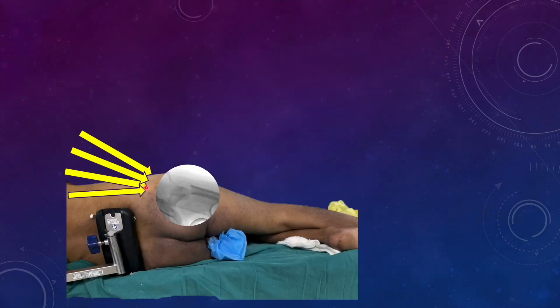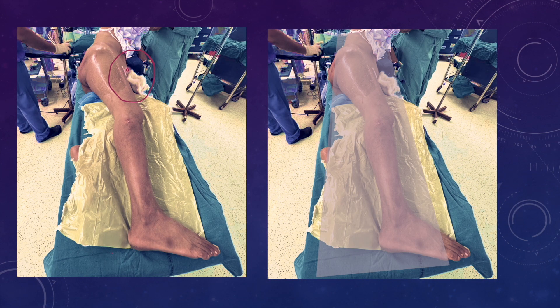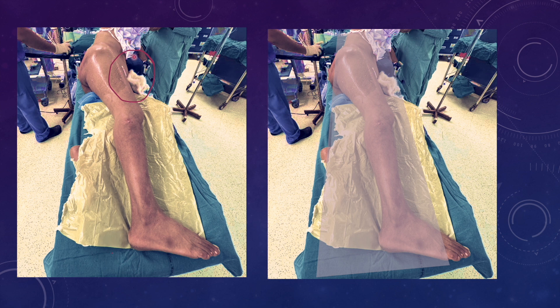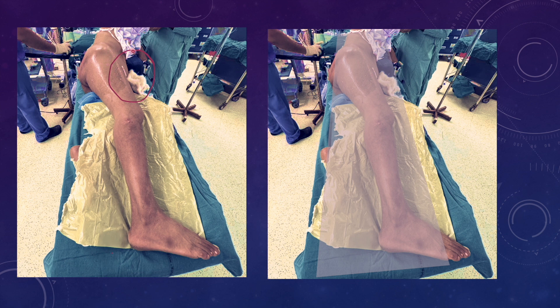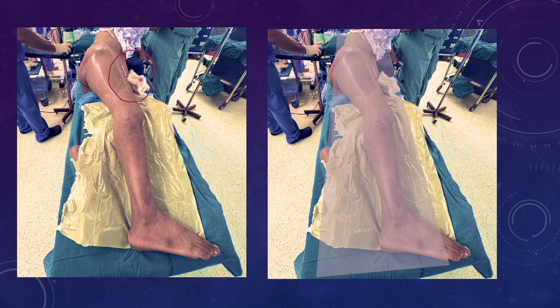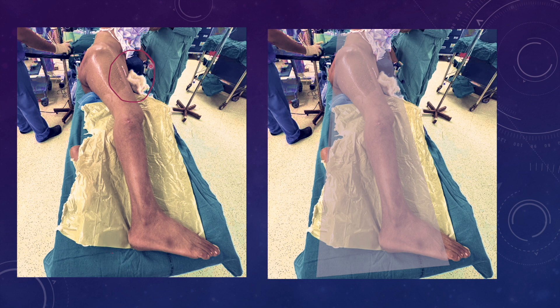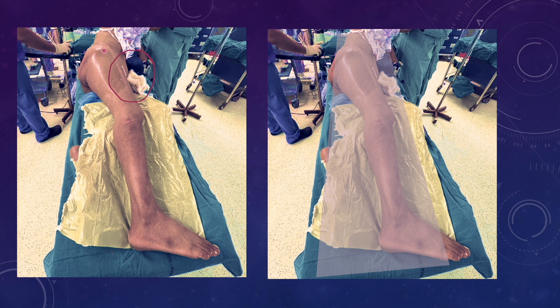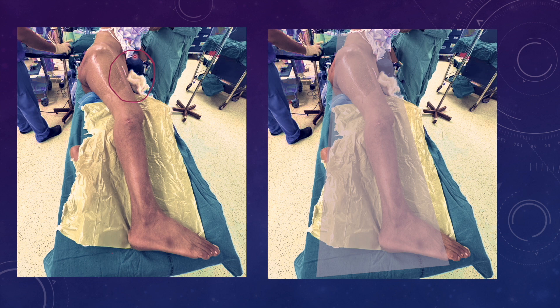Whenever you are attempting the lateral position, the first thing you need to check is your C-arm views. Sometimes the metallic edge of the table is actually blocking the C-arm view, so you have to keep the patient slightly central on the table to see the proper view. Another important thing: whenever you are doing nailing in lateral position, you have to ensure that the pelvis is tilted in the anterior direction. If the right side is being operated, the pelvis has to go downwards on the opposite side. The anterior support should be a flexible one — we put a pillow so that the patient can be tilted anteriorly. You should not maintain a purely lateral position; you have to tilt the pelvis anteriorly to see the proper view of the proximal femur.